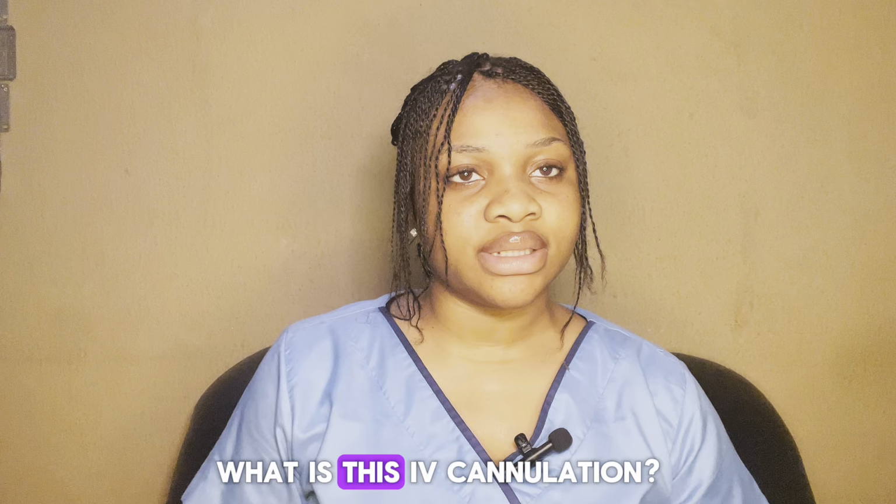In my last video we talked about IV cannulas: the definition, the uses, the contraindications, the indications, and the sizes they have. This video we're talking about IV cannulation instead of the IV cannula: the procedure, the requirements, and the purpose of IV cannulation. There will be a demonstration in this video, and hopefully there will be a special guest. So without wasting much time, let's get right into the video.